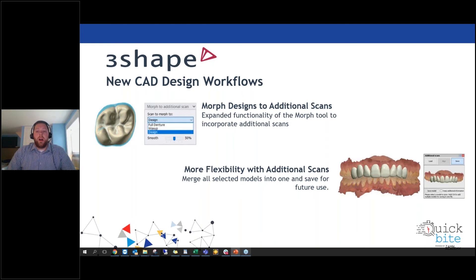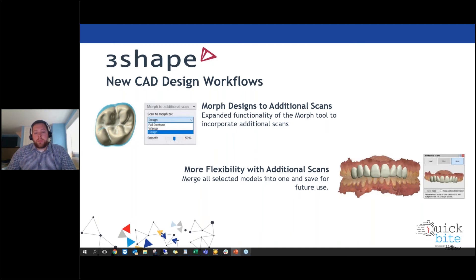The second improvement in additional scans is the ability to combine scans. It is now possible to merge all selected models into one and save the combined design for future use. Any changes made are saved in an extended scan, allowing virtual mock-ups straight from the design or preparing models for future use. This functionality is available in the right toolbar under the additional scans feature, using either 'save design' or 'load an existing design' options.